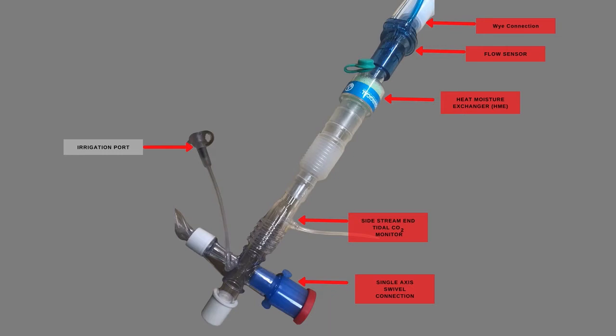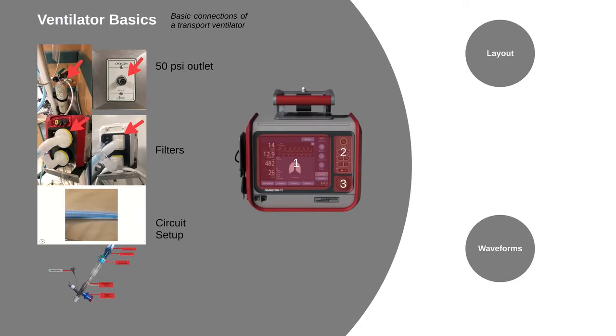Keep in mind that everything that we've added after the Y is added dead space to our circuit. So it's important to take note of that. This is a short video on the circuit setup in the research room.